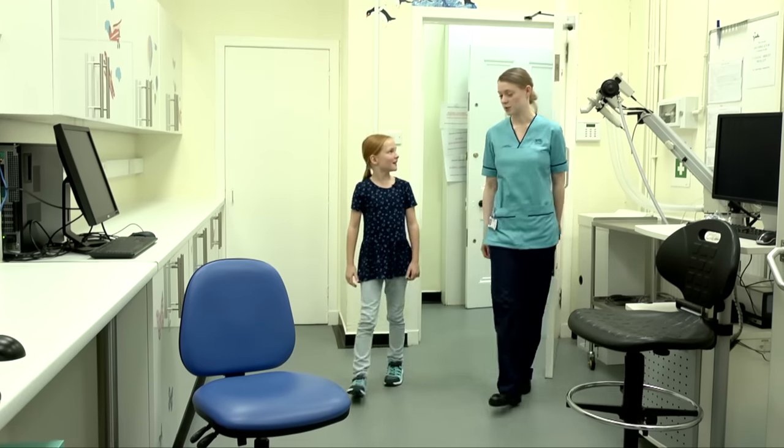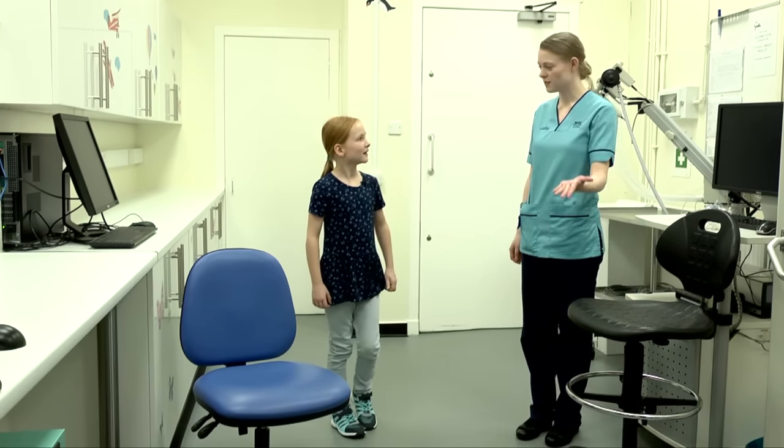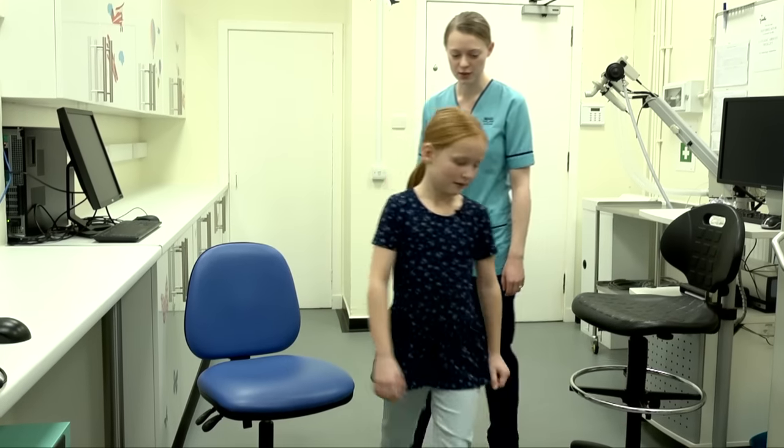Thanks, Susan. This is where we do our breathing tests. Thank you for letting me film today. That's okay. Do you want to have a wee seat and then we can have a chat about what we're going to do today? So, Susan, do you take any medications? No. Have you been in hospital for any reason in the last 6 weeks? No. So, once we know that if things are okay, we can get started with explaining the test.